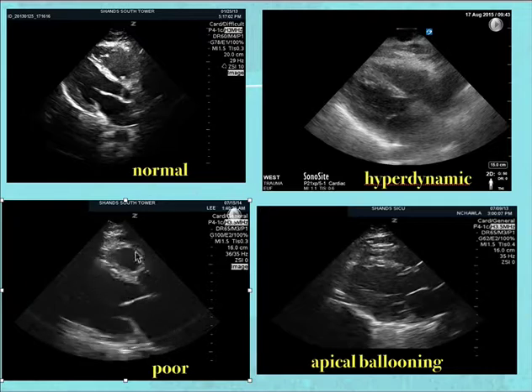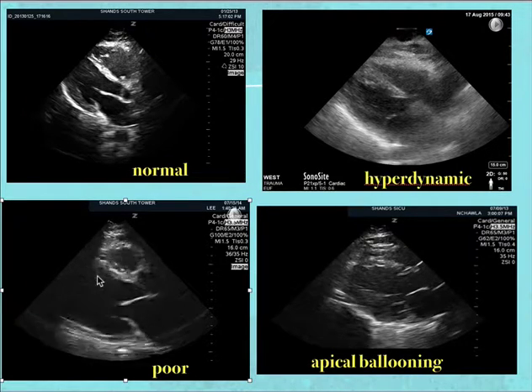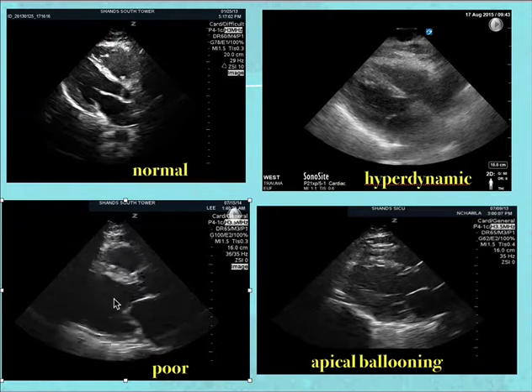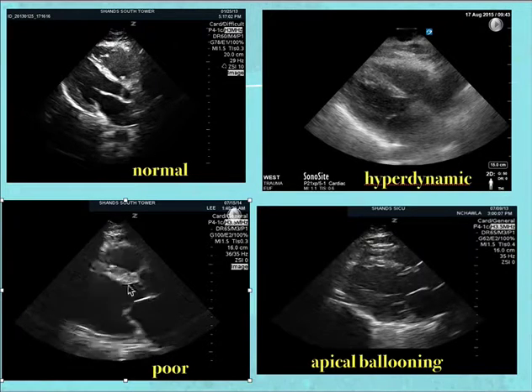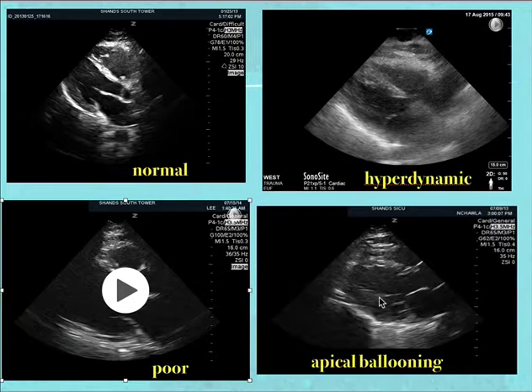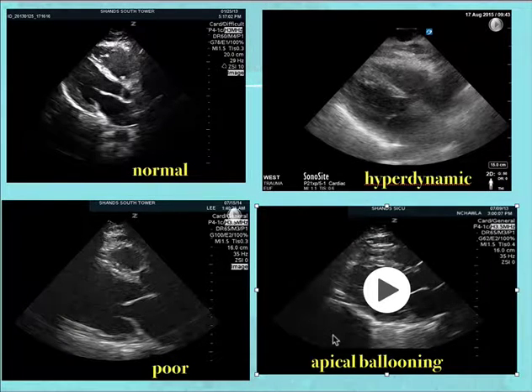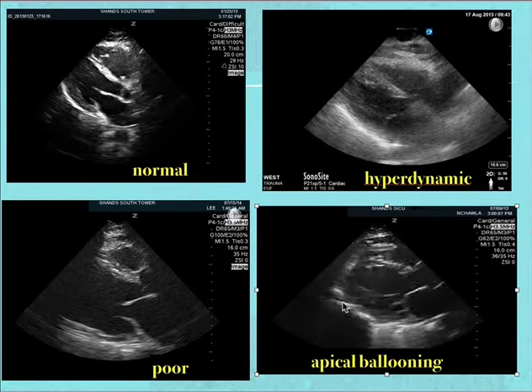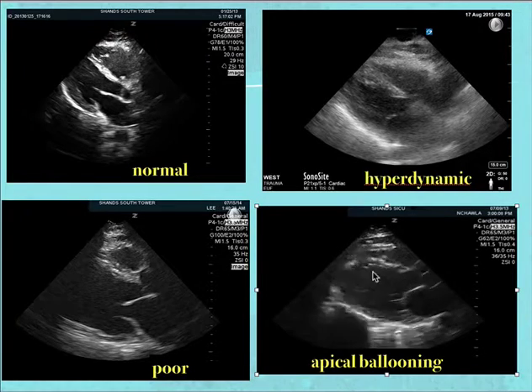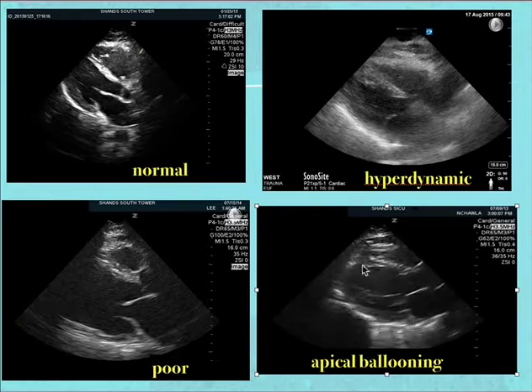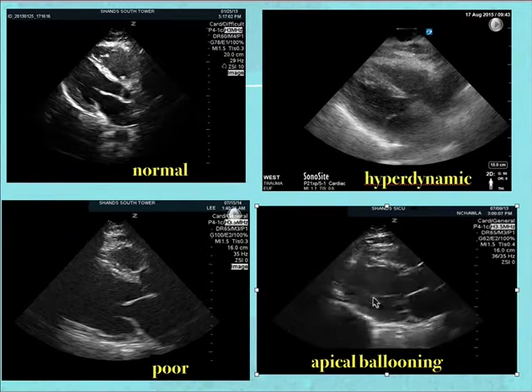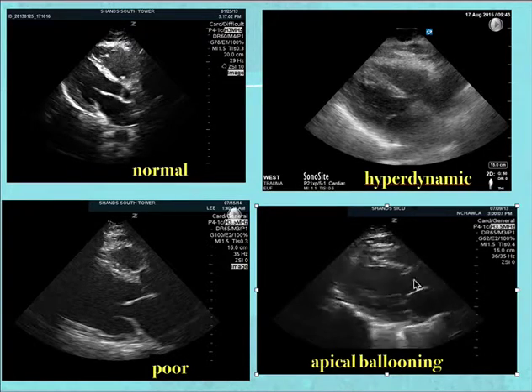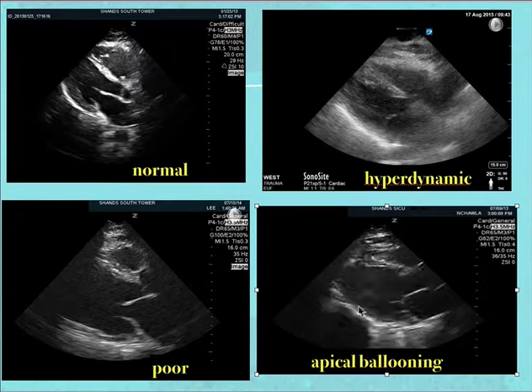Now looking at poor function in the parasternal long view — you see a dilated left heart, and the mitral valve is barely hitting the LV wall, indicating poor LV function. Here's an interesting image from a neurosurgical ICU patient showing apical ballooning, sometimes seen in Takotsubo cardiomyopathy. Whenever you see apical ballooning, it should suggest poor left ventricular function. There's a large space between the mitral valve and the LV wall, indicating very poor LV function.